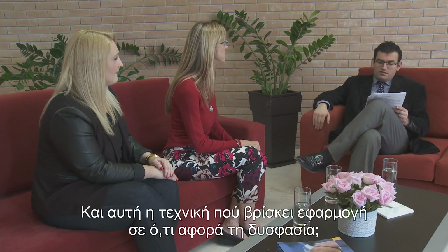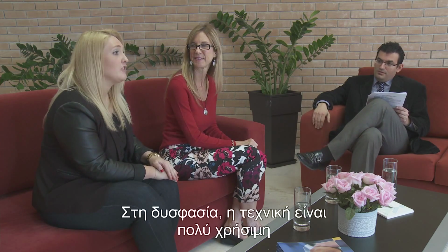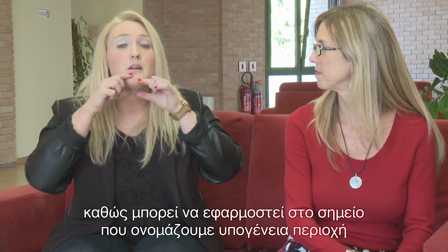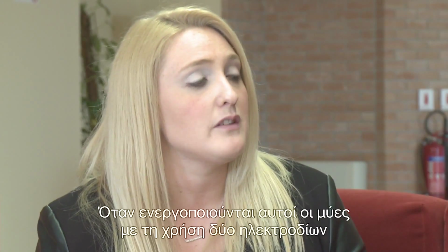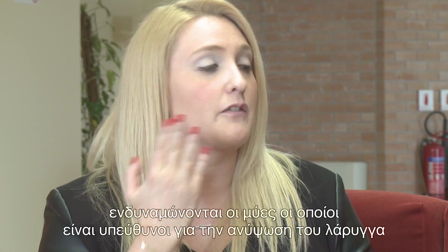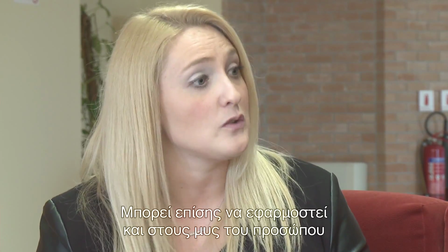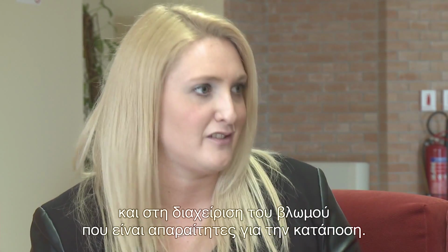And what are the applications of this innovative technique in dysphagia? Well, for dysphagia, the technique is quite helpful as it can be applied to a specific area called the submental region, or more specifically, the suprahyoid muscles. When these muscles are activated by applying 2 electrodes, it can help strengthen the muscles responsible for the elevation of the larynx, which in turn helps our patient swallow safely and more efficiently. There's also an application for the muscles of the face, which often plays an important role in the chewing and manipulation of the bolus necessary for swallowing.